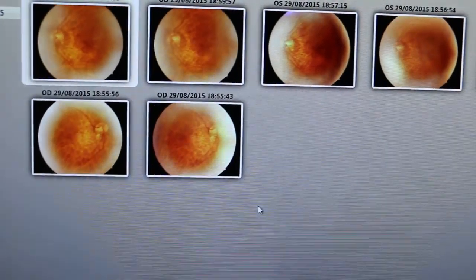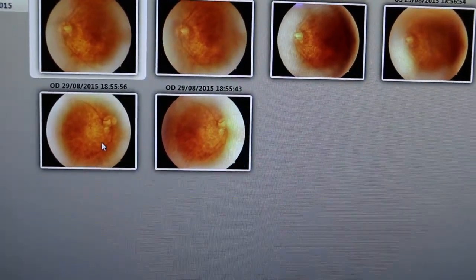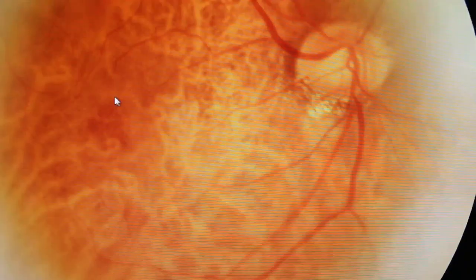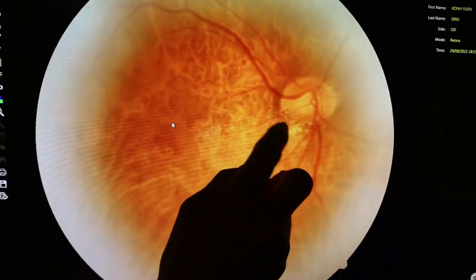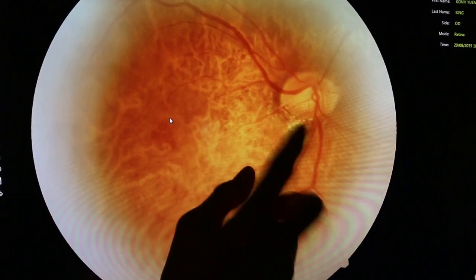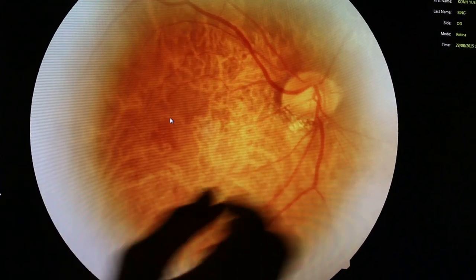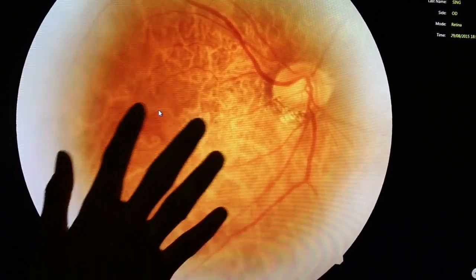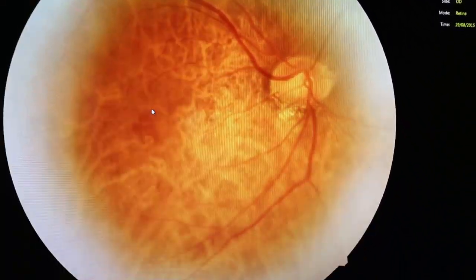Now the right side — I'm going to give you an OD. This is a better picture so I'm going to give you this one. Same thing. A little bit of myopic crescent — that happens in people with strong short-sightedness. You can see the blood vessels going very nicely, no problems. Macula is clear, no dot and blood hemorrhage. You're healthy.